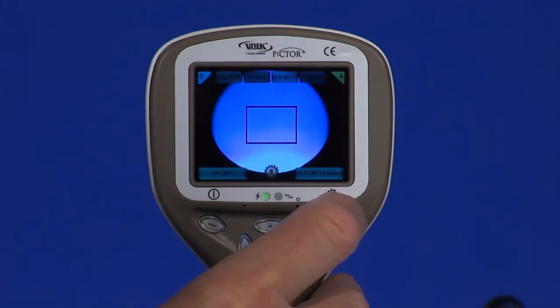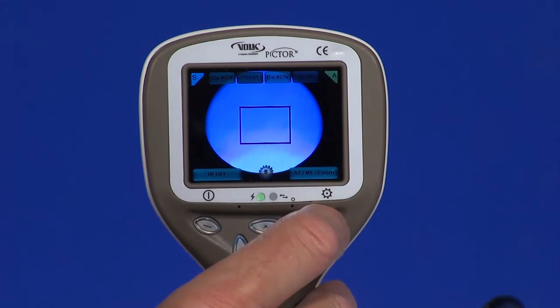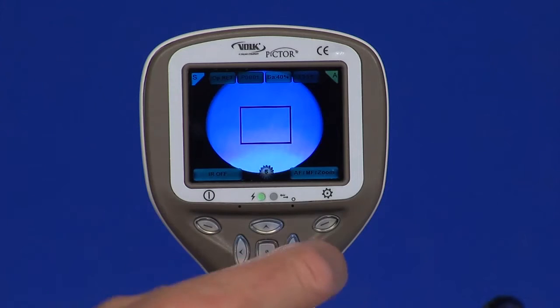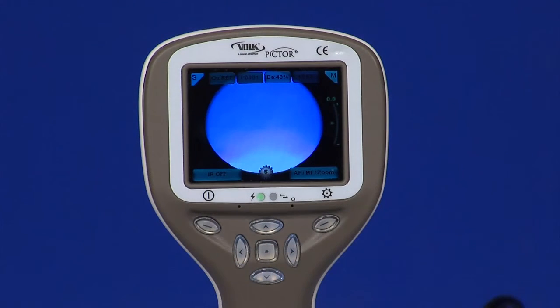Either autofocus or manual focus can be used. Autofocus range is minus 11 to plus 3 diopters. Manual focus range is minus 20 to plus 20 diopters. Manual focus is recommended for best image quality.